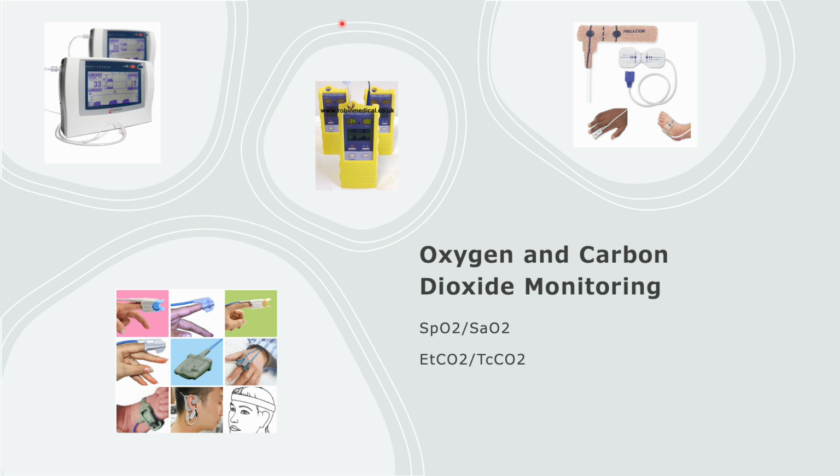Capnographs are used to measure carbon dioxide retention. End tidal capnographs use a cannula to measure the highest point of CO2 during respiration, which is at the end of a tidal breath, hence the name end tidal. Sometimes you can use the same cannula as you would the nasal pressure transducer, but sometimes you have to use an additional cannula on top of the cannula used for nasal pressure. The yellow machine here you see we had at Raleigh, and they use special cannulas that you have to buy, and they actually have a gold tip on the cannulas, and if you don't use those cannulas, the machine won't work.